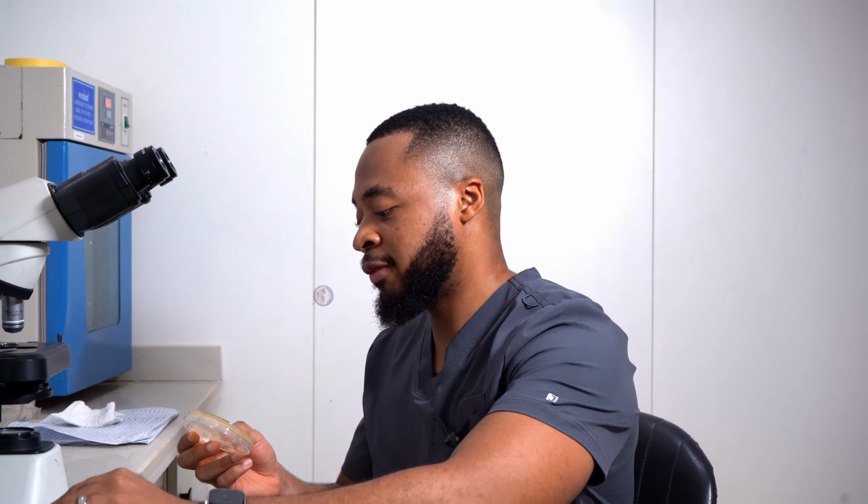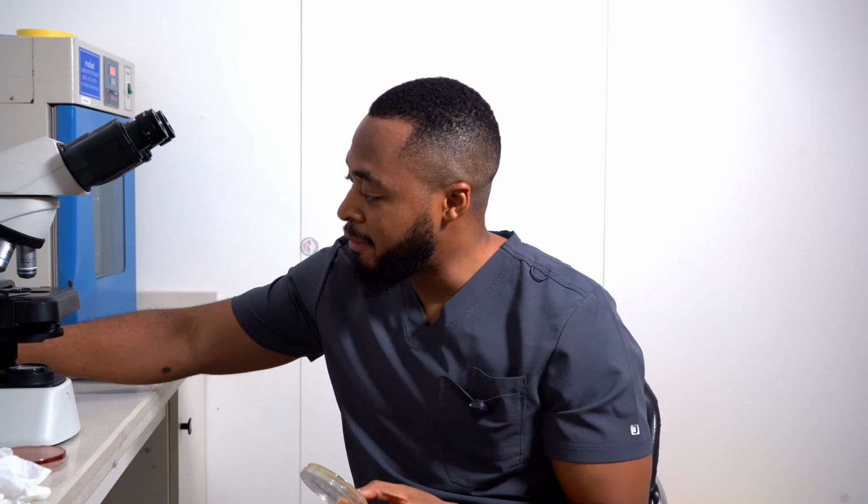The final step is sensitivity, the S in MCS. It involves this new Petri dish. So when we see the salmonella, like I explained earlier, we take the salmonella from this plate and transfer it to this one and spread it across. The magic now happens in this. We now plant different antibiotics on this dish.